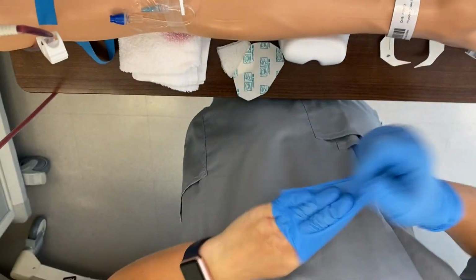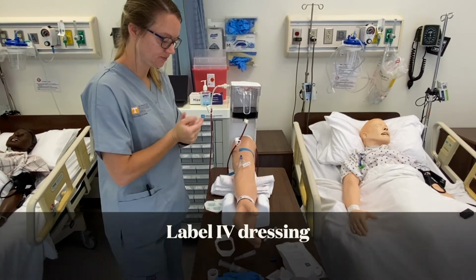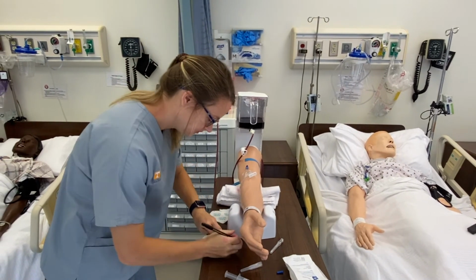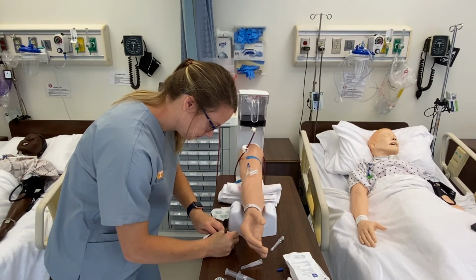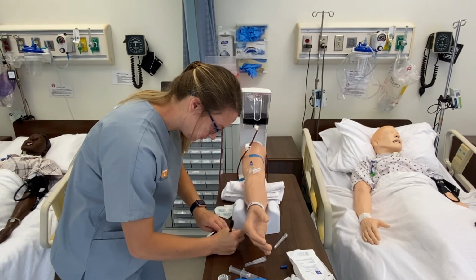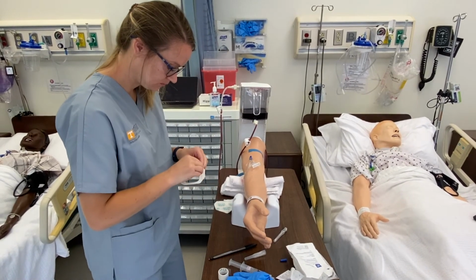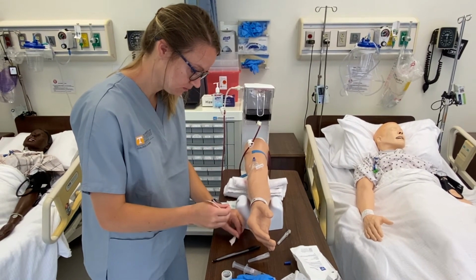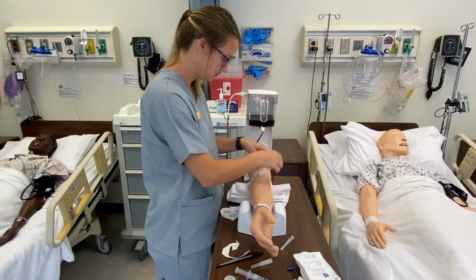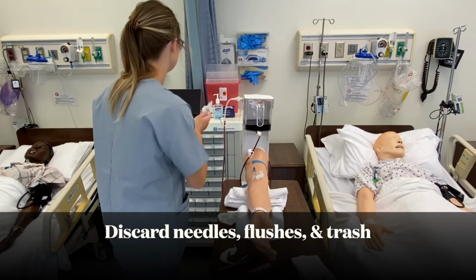Remove gloves. Perform hand hygiene. Label the IV dressing with date, time, and initials without writing on the patient. Discard needles, flushes, and trash into appropriate containers.